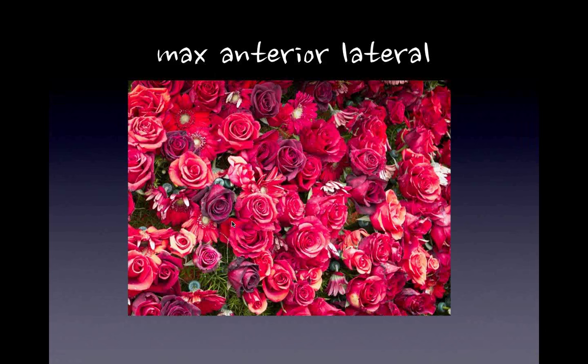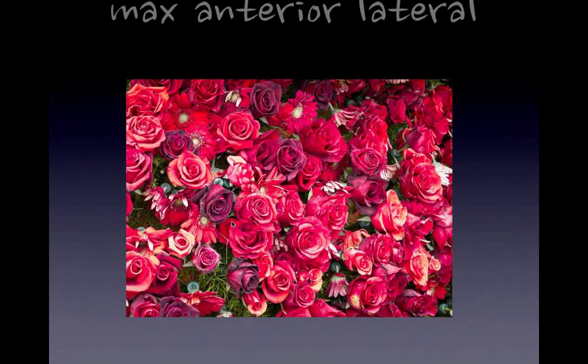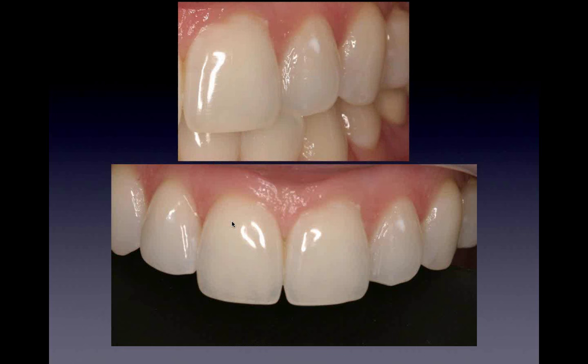Let's go to maxillary anterior lateral, which actually, I'm sorry, I changed that to an anterior. Oh, that's the lateral. I'm sorry. That's the lateral. This is a small change. The patient couldn't afford the veneer, but she had this lower tooth hitting her lateral there. And you see how it's kind of rotated in and lingually, and you have a little bit of a step here. So we wanted to bring it out facially, but also get rid of that occlusion. So I want to change the environment. I'll go ahead and recontour the lower tooth just so it gets out of the way of the occlusion, make sure her guidance is okay, and then start interproximally cleaning her up and starting the preparation.